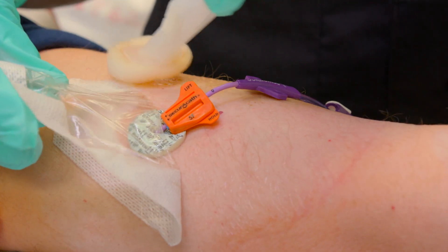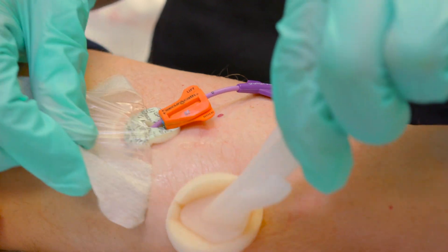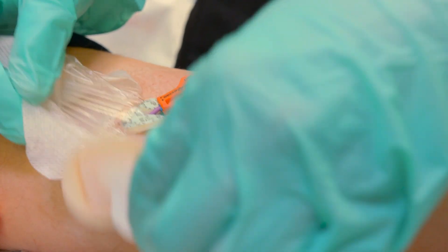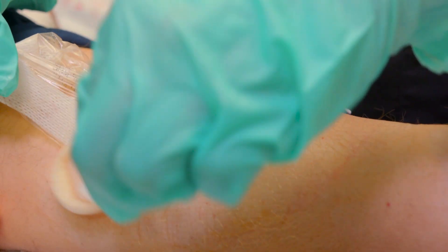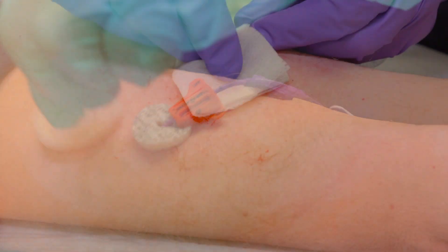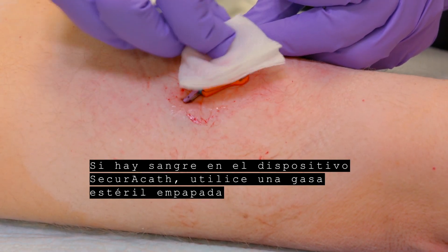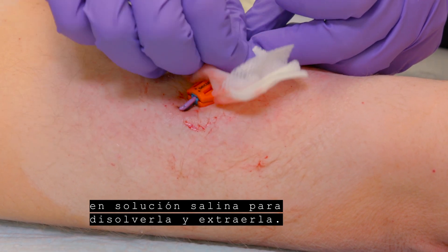Remove dressing. If blood is present on the SecuraCath device, use a sterile saline soaked gauze to dissolve and remove it.